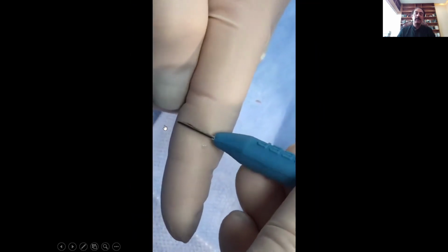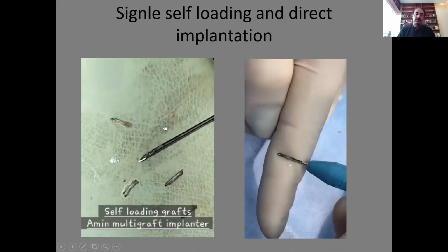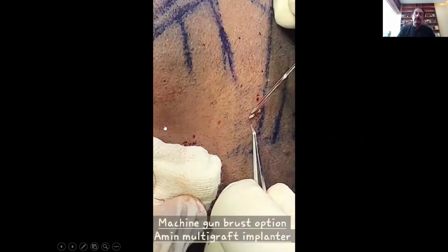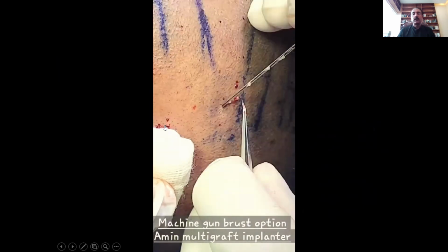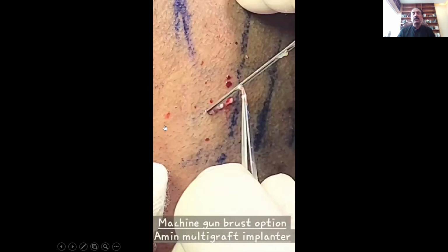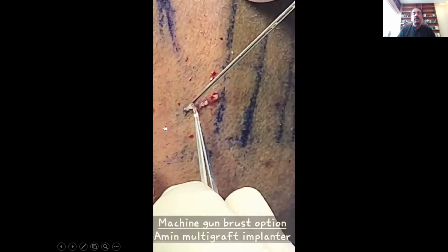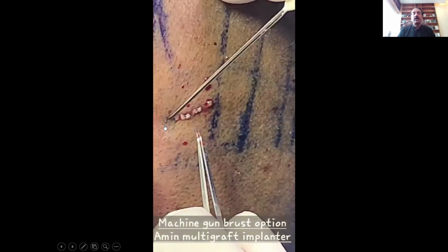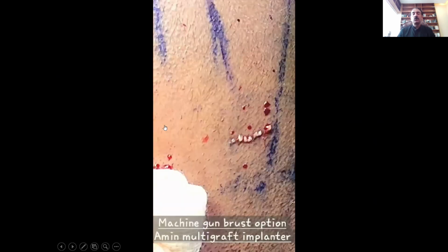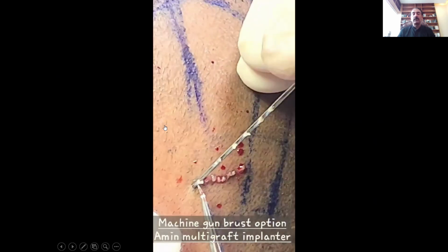This is the Keep implanter. It's a good device, but we have to use it in pre-made slits. Then you can use it as a machine gun fire as well. You can load 8 to 10 grafts in a sharp Amin multigraft implanter, and you can directly implant these grafts. You can see how quickly the grafts are implanted with a sharp Amin hair implanter. You can feed 6 to 8 grafts in a single sitting and implant them. You do not need too many technicians to fill the tubes. It's quite easy and simple.